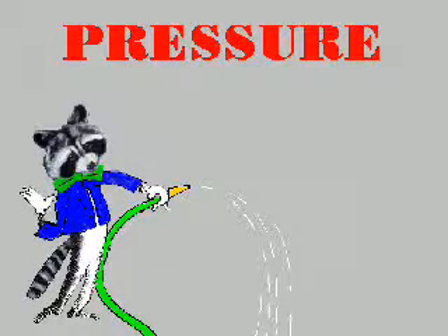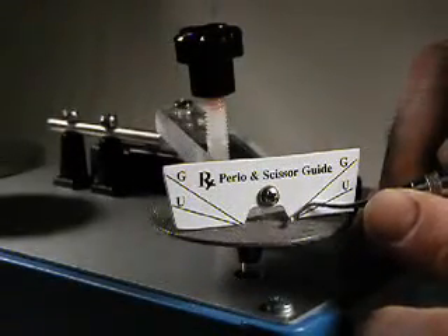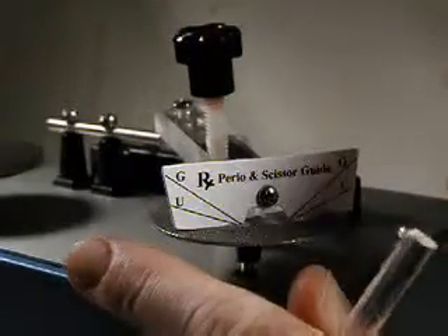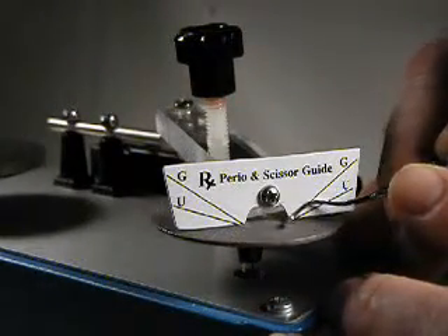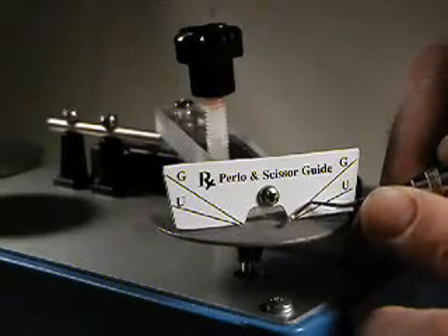Only minimal pressure is required while sharpening. This is especially true when using the diamond disc. Check for sharpness after three to four light strokes using your test stick. Frequent checking helps eliminate over-sharpening of the instrument. Note the light pressure and the heel-to-toe motion.